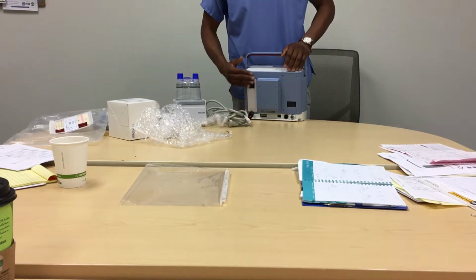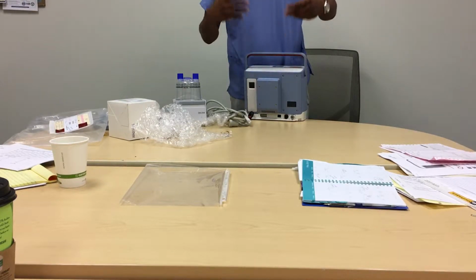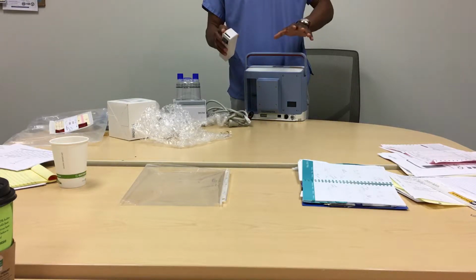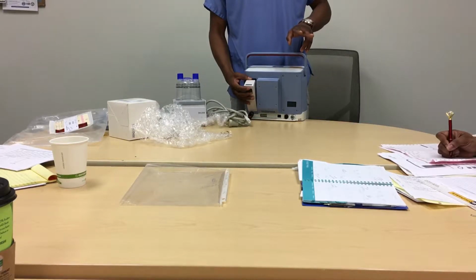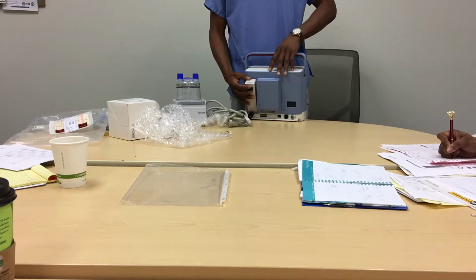Typically, with patients I've seen who are trached and have an outdoors lifestyle, they tend to get 2 or 3 of these at a time. They could also request an external battery charger, which will charge 2 of these at a time too. Every time the unit is plugged in, it will charge the internal and the external together. Then if there's a power outage, it pulls from the external first before the internal.